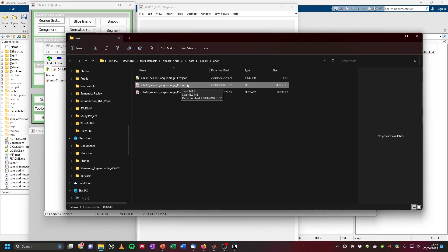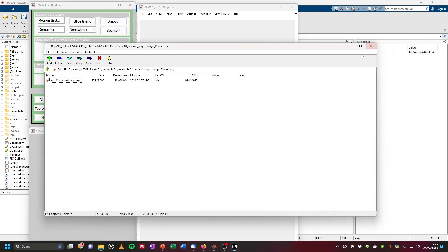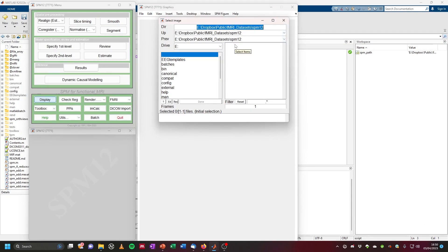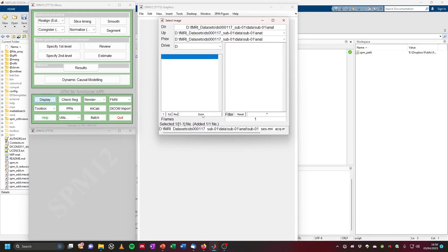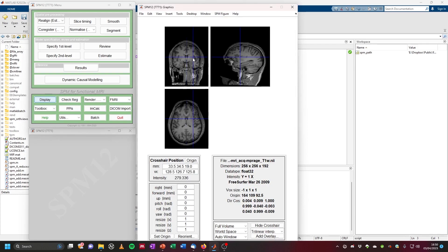We can look at this using Mango or SPM itself by going to the display option. Copy the path of the folder, then in SPM click on display, paste the folder path in the directory field, and here we have the NIfTI image. Click on it on the right side so it's selected, then click done. And here's our structural T1-weighted image of the subject.